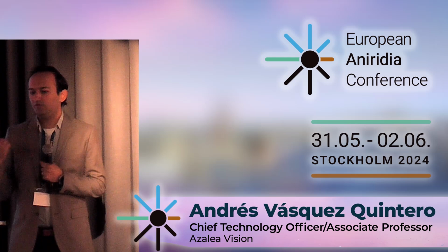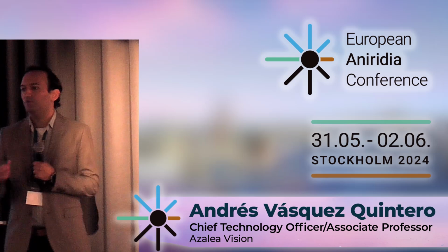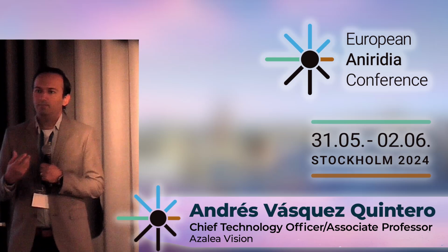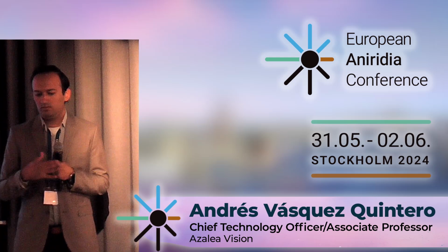That's clear. Now we started with the first step, which is to put it on a rigid scleral contact lens. Then immediately we can think of soft contact lenses for other applications. And then thirdly, we can think of IOLs, smart IOLs. So we just finished a postdoc European project on smart IOLs, and the intention is to put, again, electronics into an IOL. Then it will be a little bit less complex than we have here. Because if you think of putting a micro battery inside an IOL, it starts to be very complex also to prove safety. But we believe that with this type of devices, we will create a pathway, especially towards the regulatory agencies like the FDA, etc., that these devices can be safe in order to take the next step to go into smart IOLs.